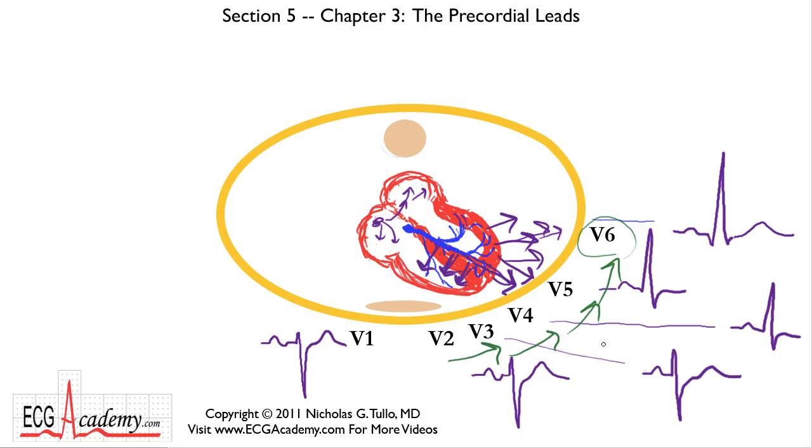So when you look at a 12-lead ECG, you should see this kind of R-wave progression across the precordial leads, and that tells you that all the electrical signals are in their proper position. You can imagine that if the precordial leads are not in the right position, then the R-wave progression will not look normal. And people will be tempted to diagnose all sorts of problems like old infarctions and crazy conduction abnormalities. So putting those leads in the proper position is definitely important.